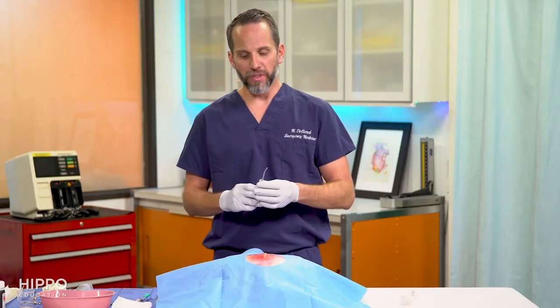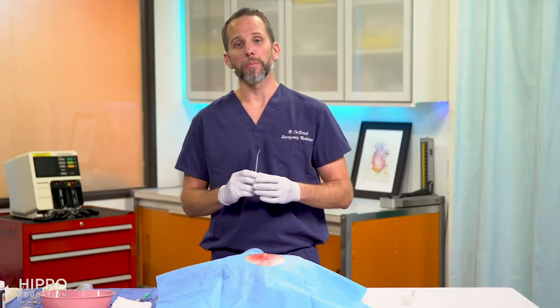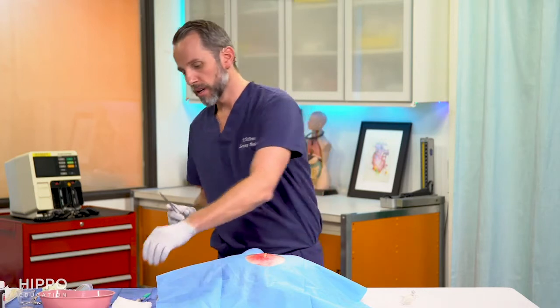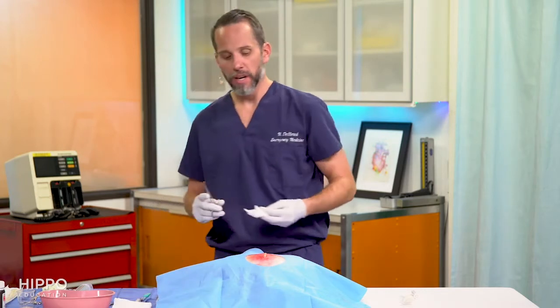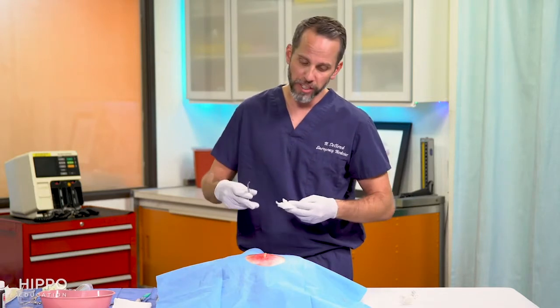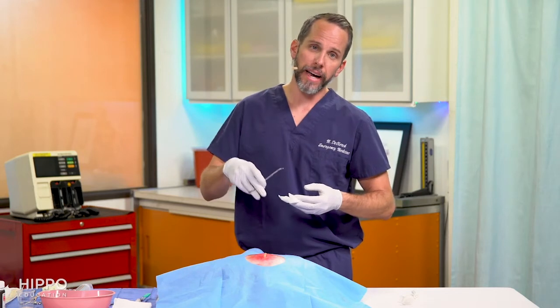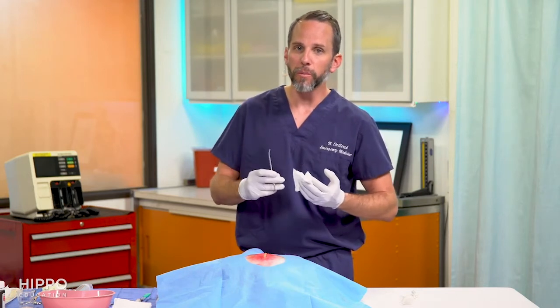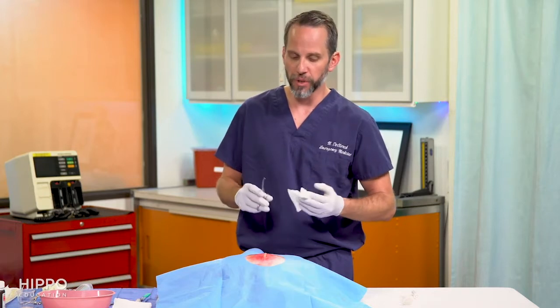The next step in terms of this I&D, and probably the most important part, is going to be blunt dissection. So basically, you're going to be taking your blunt curved forceps. You want to get a couple 4x4s with this. And this is also the part that is the most painful for the patient. So if you need to reintroduce some lidocaine into that abscess after you've opened it, you can do that. But just remember, you want to move cautiously and gently because it is pretty painful.